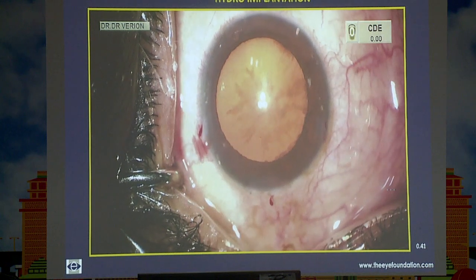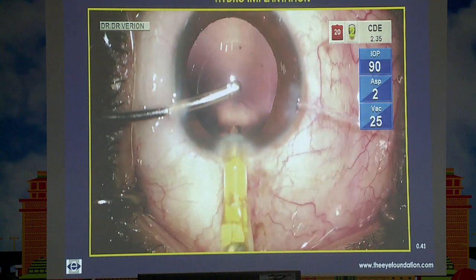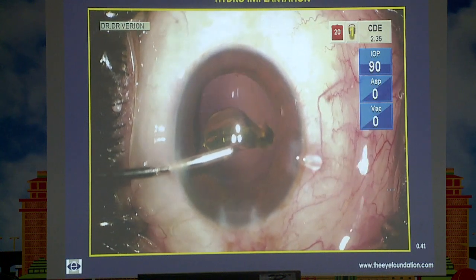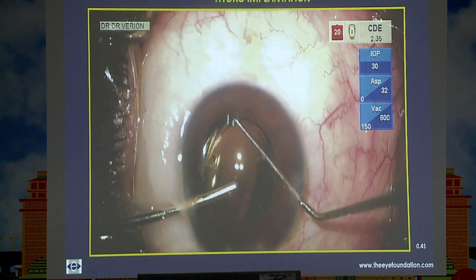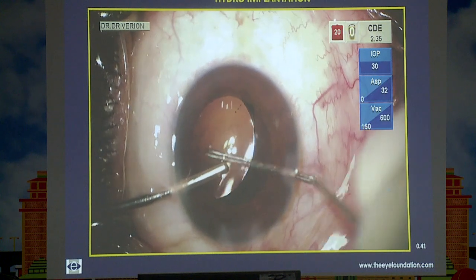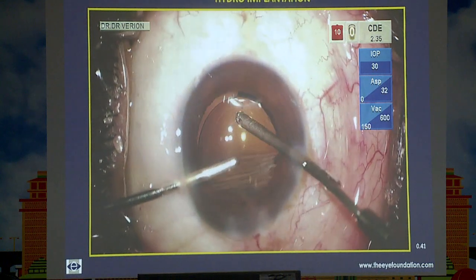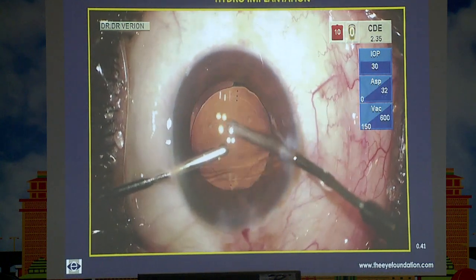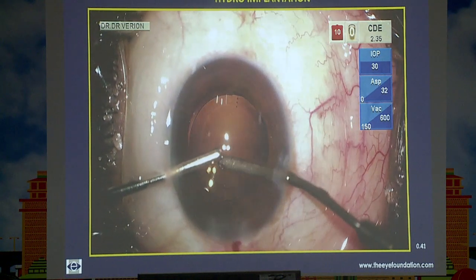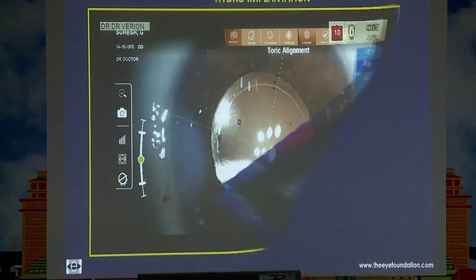And nowadays what I do is this hydro implantation, where once the nucleus has been taken out, we just have the irrigation cannula in place. I specifically chose this video because you can see the lens appears to be a little uncontrolled, but even in these cases you can manage them quite well, position them accurately, and then with just the irrigation flowing you can position these lenses very well. That does away with the variability of having to remove the viscoelastic completely. And usually what you find is the way you left the lens is the way it remains post-operatively.